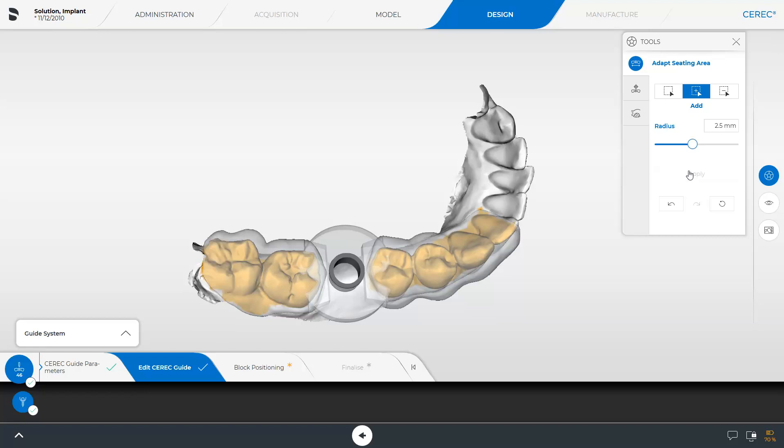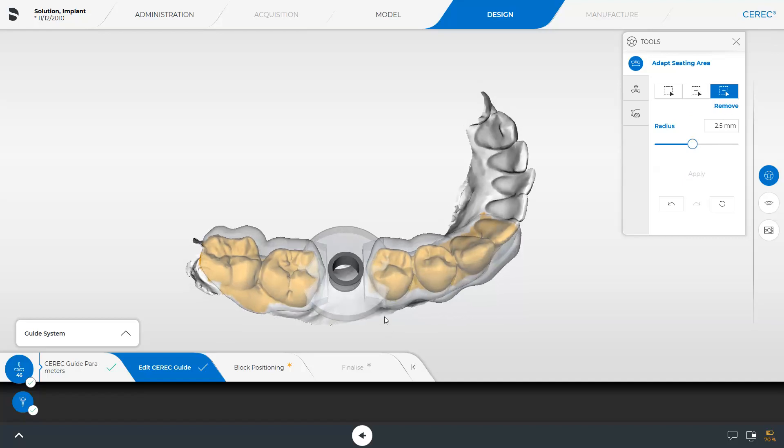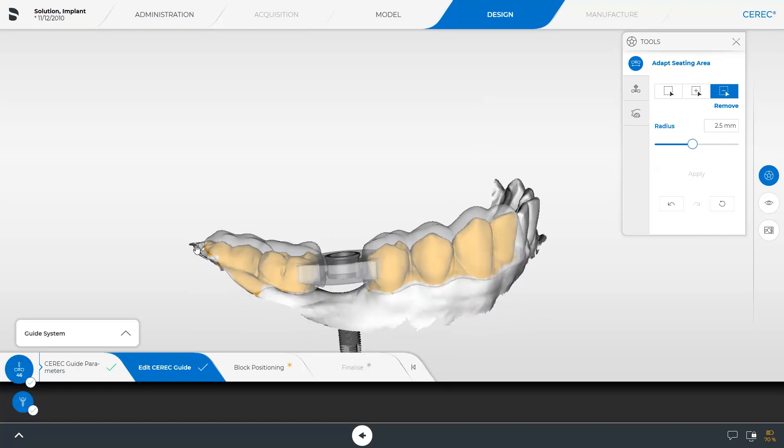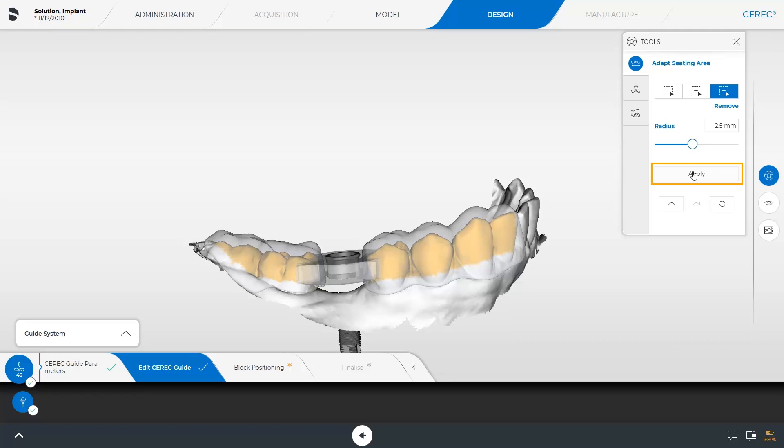Now we enable the Remove function. We move the cursor to the edge of the surgical guide and mark the area to be removed. By confirming with Apply, the guide will be shortened by this area.